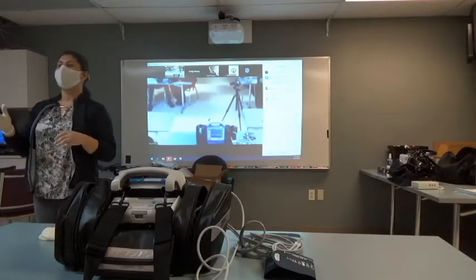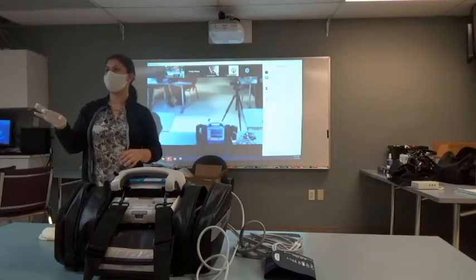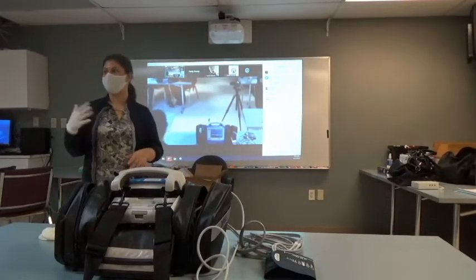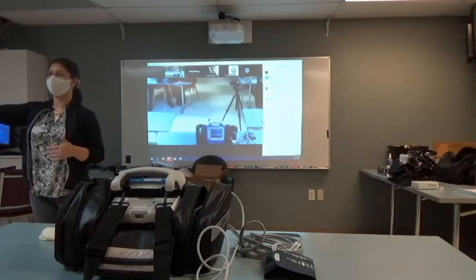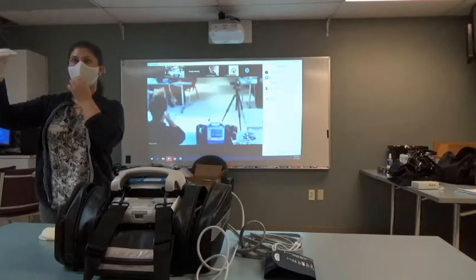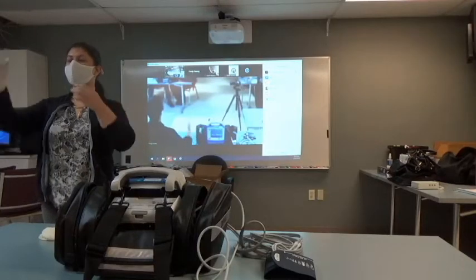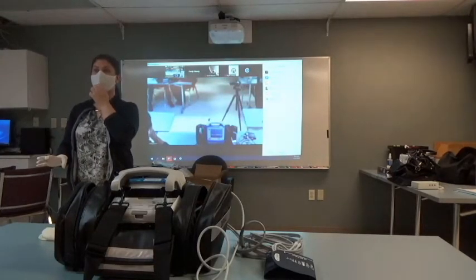Yeah, so my recommendation is when you guys are powering on, leave it at a single lead. The reason for that is the vitals will stay nice and large down at the bottom. The more we put on the screen, it's going to push the vital signs over to the right and make them a little smaller, okay? We can hold up to 4 different waveforms on the screen. So we want to make sure that we have the important stuff on there. Capnography will override anything. And then you'll always have your top lead, and then your CPR feedback will be at the bottom as well, okay?